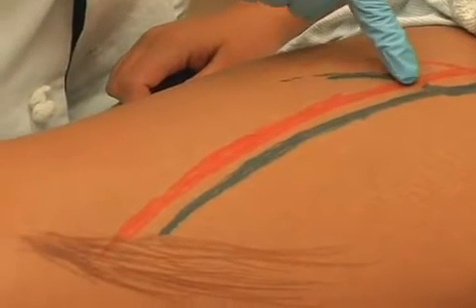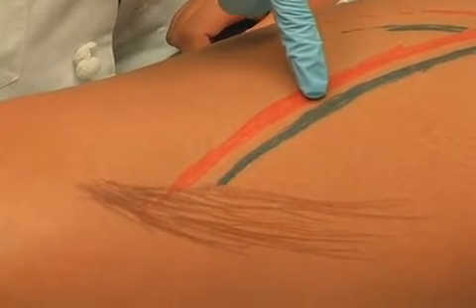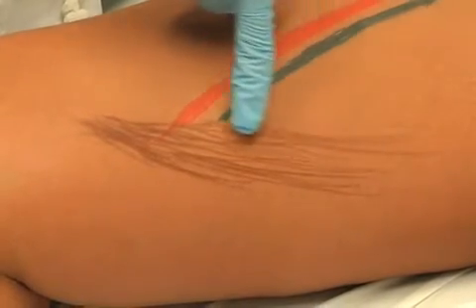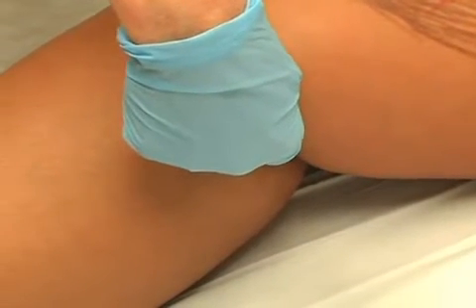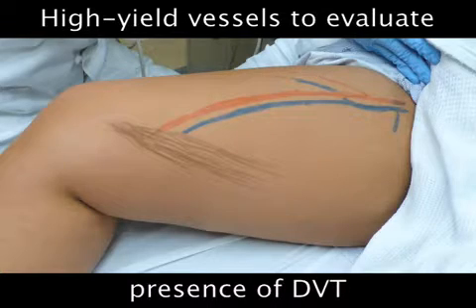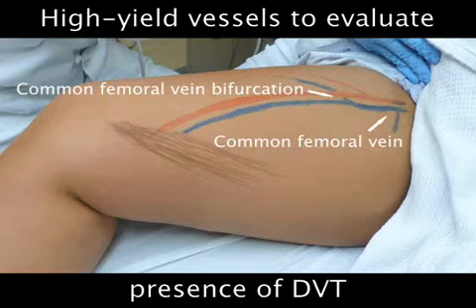The superficial femoral vein runs distally in the medial aspect of the thigh and is easily seen by ultrasound. Near the distal third portion of the thigh, the femoral vein runs posterior to the muscle and emerges in the posterior-medial aspect of the distal thigh as the popliteal vein. The popliteal vein continues beneath the joint and splits into 3 branches that do not need to be imaged in the emergency department. While some controversy from other imaging specialists exists, prospective studies direct focused, detailed imaging of high-yield vessels at specific locations to evaluate for the presence of DVT.